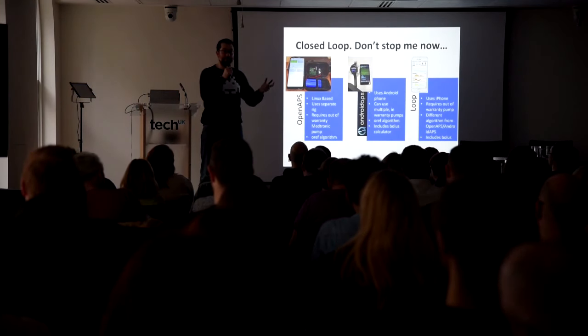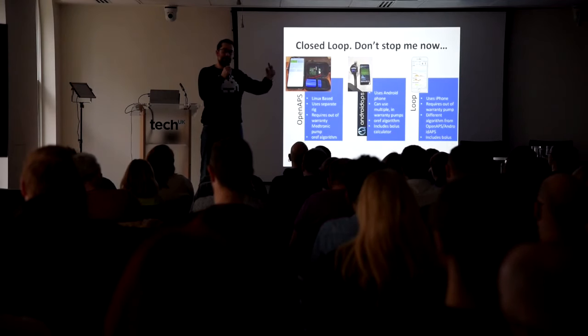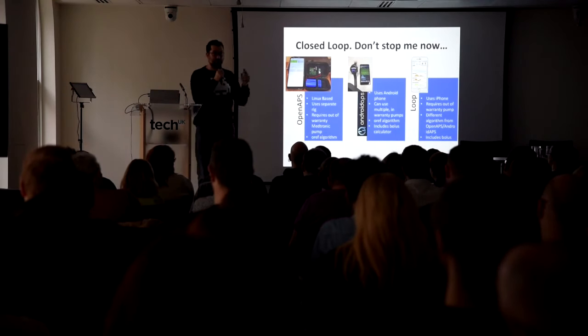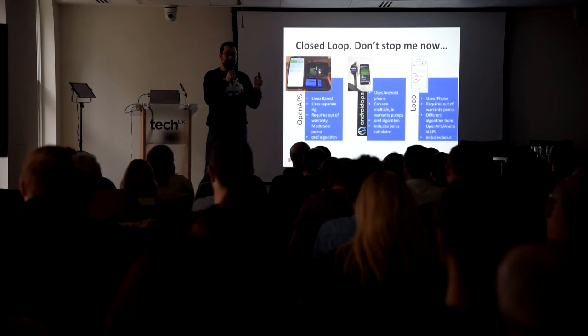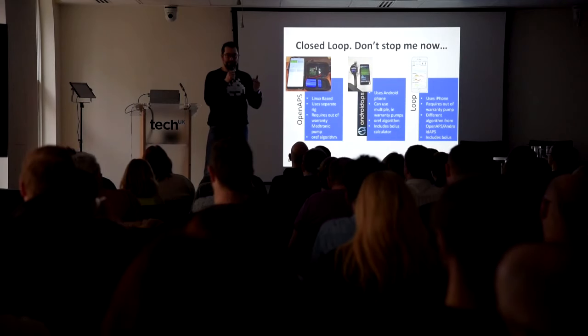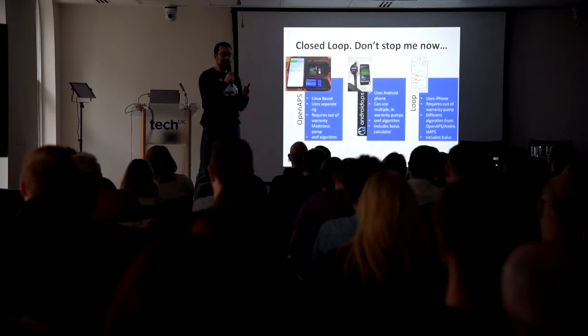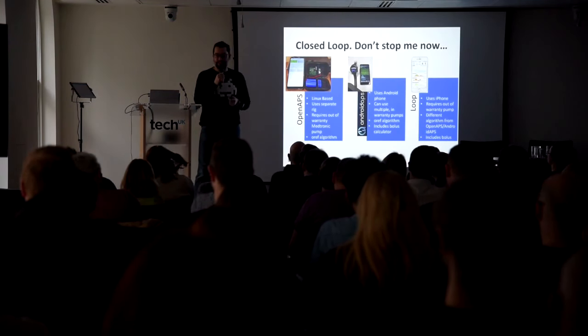macronutrients in pizza, and it will work out how to put carbs into the system so that it gives the right amount of insulin over the long period of time it takes to absorb the pizza without you going high. He's done lots of tests on it. There's a couple of videos on YouTube. But that kind of stuff is being done by the open source community to try and make living with some of these things easier.